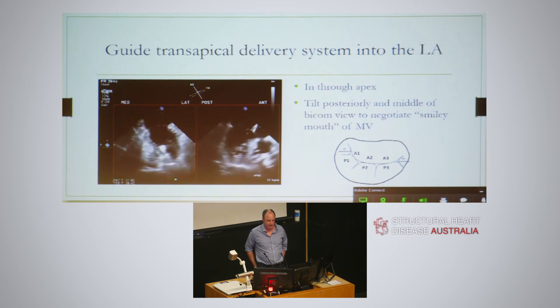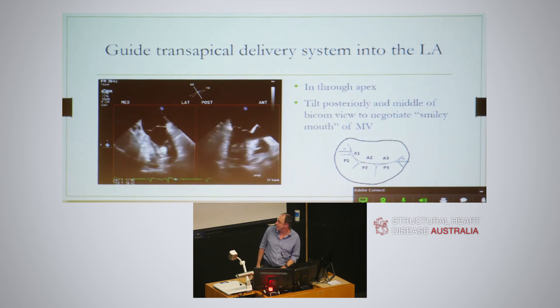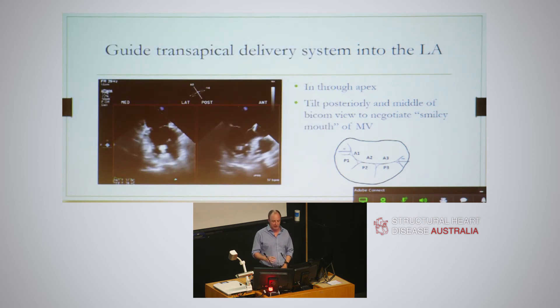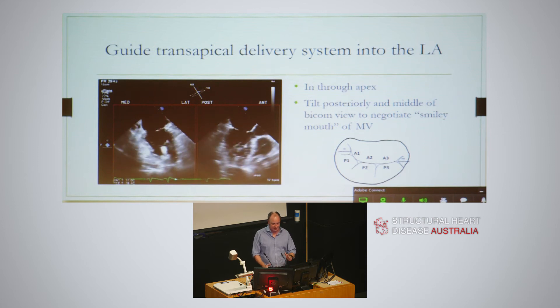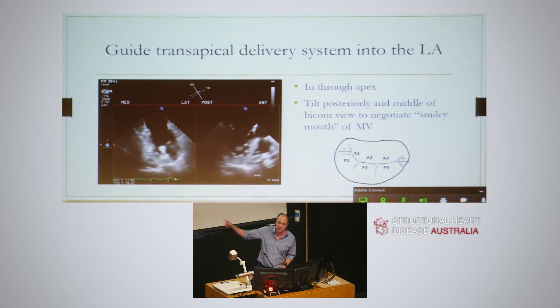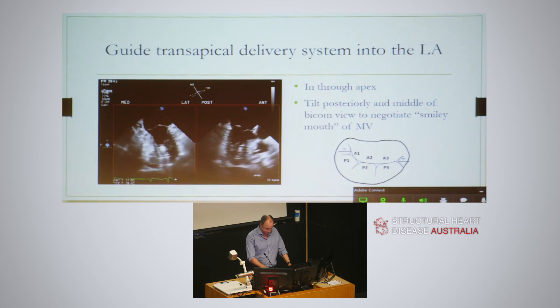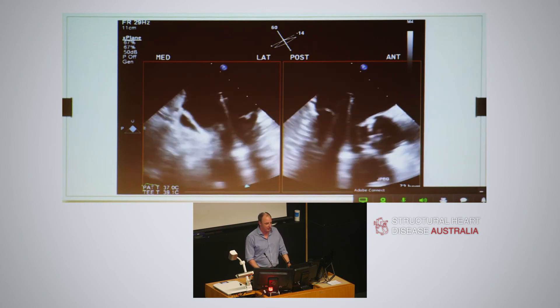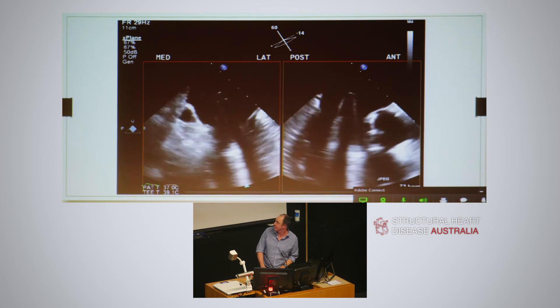Getting the transapical system into the left atrium: here is the system within the left ventricle. You've got to bear in mind that you've got a smiley face - the mitral valve - so you've got to negotiate your way through it. As you come up you need to tilt the system posteriorly and be in the middle of the biplane view to negotiate the mitral valve. If you're heading towards the anterior leaflet, obviously you need to tilt back posteriorly. We tended to put anterior, posterior, lateral, medial on the screen to give us an idea of where we're going. With a little bit of tilt and movement we managed to negotiate out through the mitral valve and into the left atrium.